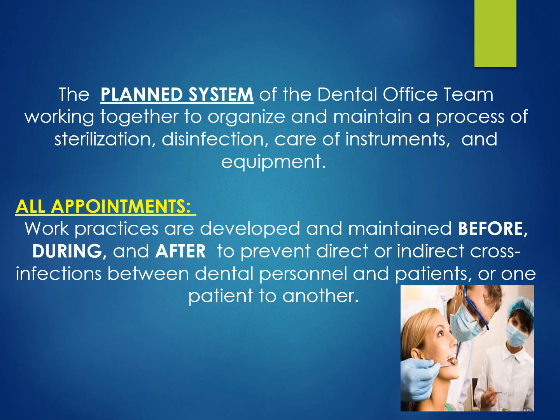The infection control procedures in the dental office and in our dental hygiene clinic are a planned system. The entire team works together to organize and maintain this process, and it involves sterilization, disinfection, care of the instruments, and all our equipment. For all appointments, you must consider your work practices, and these are developed and maintained before, during, and after our treatment to prevent direct or indirect cross-contamination between our dental personnel and patients, or one patient to another.